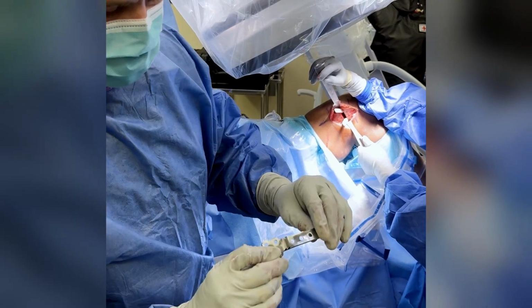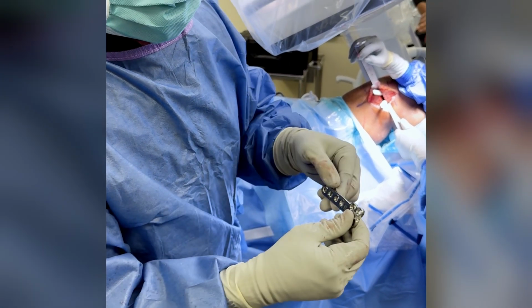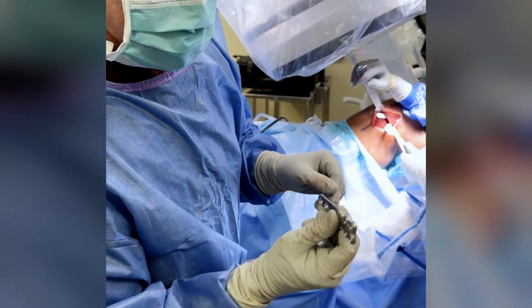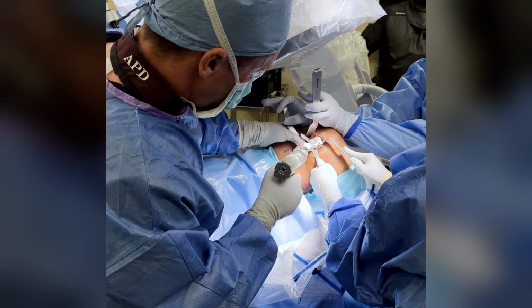Here's our plate. There you can see the custom width of our osteotomy there. That's gonna fit into the osteotomy, and then we're gonna drill our holes. It's gonna hold the osteotomy in position. So that's gonna go on next here. Drill guides over the plate.